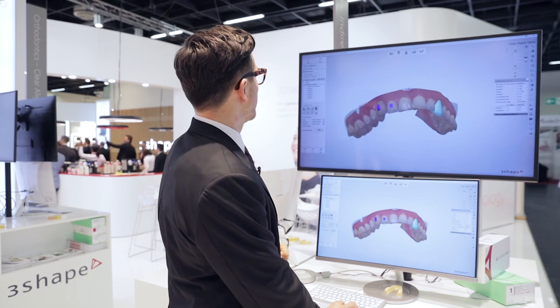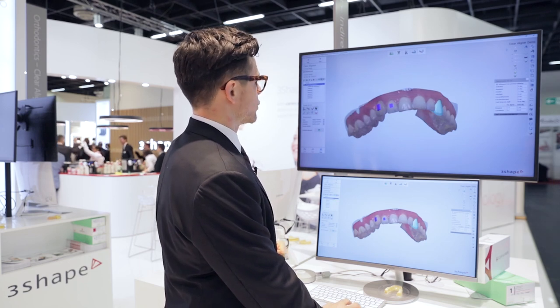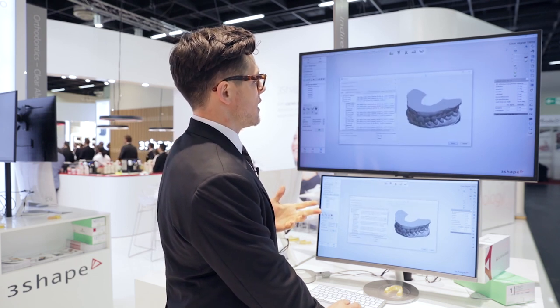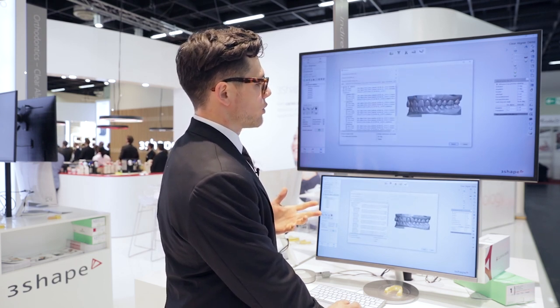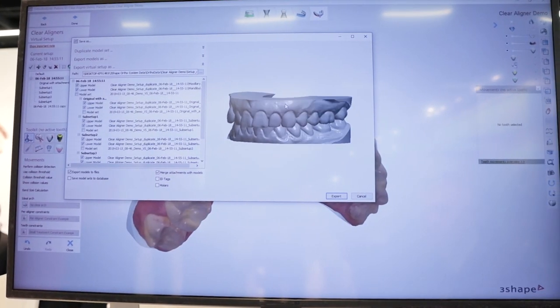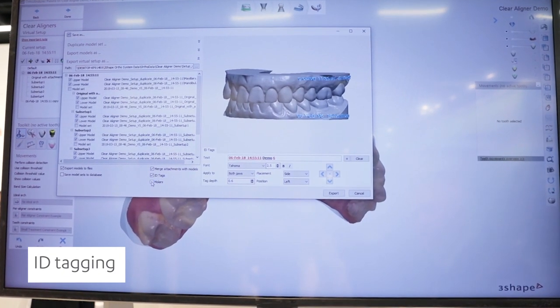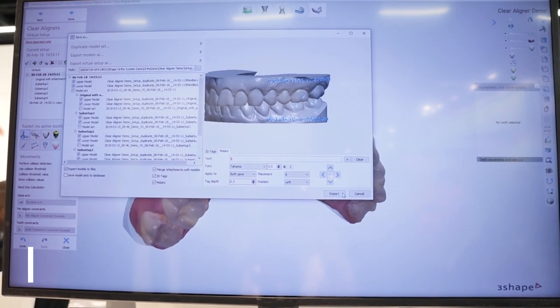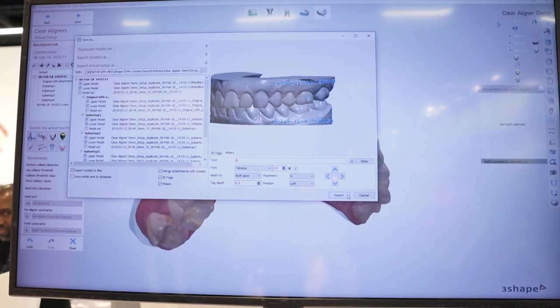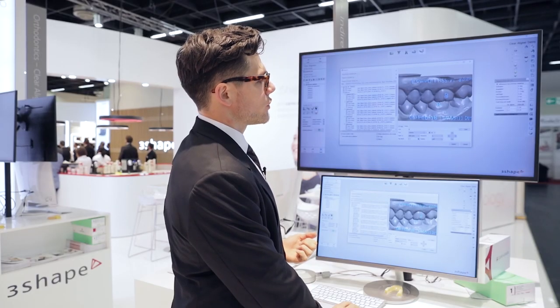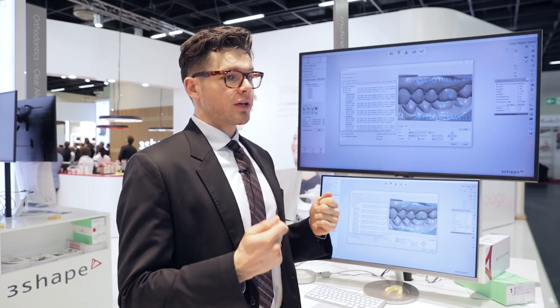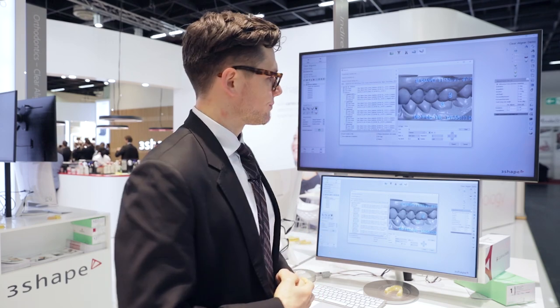The last thing I want to show you is the export function. We've added a new feature that's probably the most requested feature of all time in our ortho software — once you export your models, you can now put an ID tag on the model. So when you print them, you always know where they are and where they belong. The ID tag is fully configurable. We can even add a number to the molars so that when you do your suck-down vacuum-formed aligners and cut them out, the patient can always see which stage they're on and know where to go next.